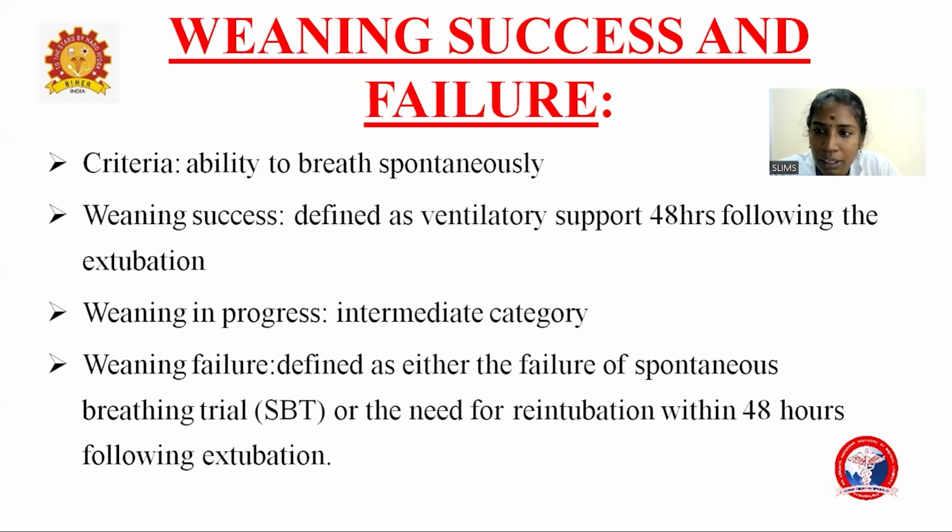So we are again re-intubating the patient. If you are re-intubating the patient within 48 hours, then whatever weaning or extubation we have done is a failure. Weaning in process is an intermediate category, where we are making the patient wean from the ventilator, doing the process. Whereas weaning success is when the patient is successfully taken off the ventilator, that is, off ventilator support for 48 hours following an extubation.